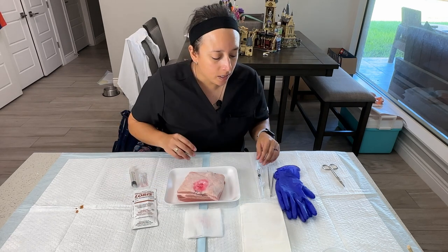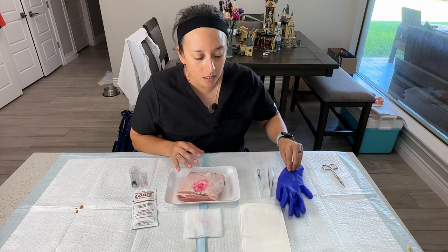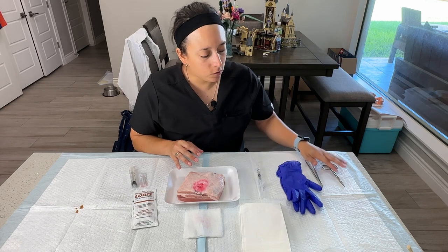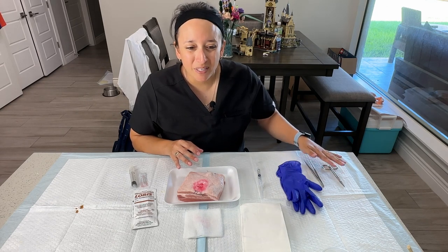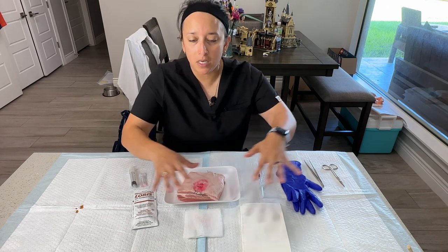Maybe some gauze. Now this is a sterile procedure. I don't have any sterile gloves, so I'm going to use these gloves in place of that. I also have some other tools that I would get from a suture kit, and I have a fenestrated drape, which would be in our sterile field.